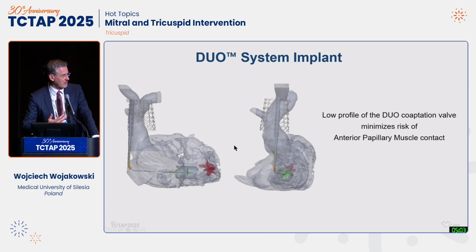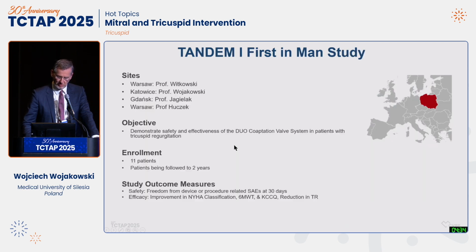I mean, it's not optimized as much as we can, just to provide the information on the worst case scenario of the SVC, because the change of the SVC size depends on the fluid status. So we try to evaluate the patient by the CT, and it also provides a way to plan the depth of implantation to avoid contact with the papillary muscle.